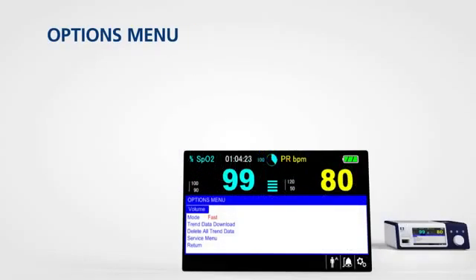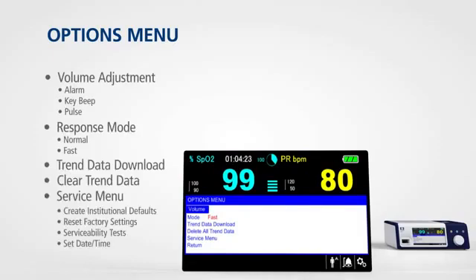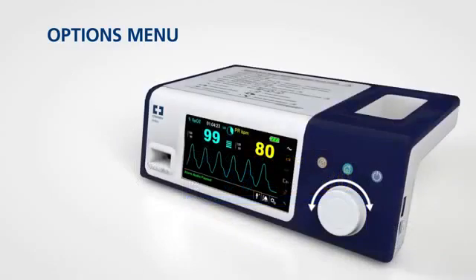The options menu provides access to settings for volume adjustments, response modes, and other settings. To access this menu, rotate the jog dial to highlight the options icon and press.